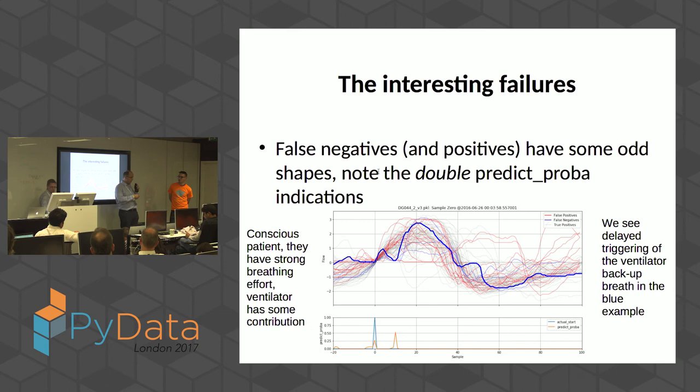Now, that's a very new approach, and some people say this is going to be the future. Some people have criticism because the diaphragm does things which are not mediated by the brain to start the breath, and has diaphragmatic activity which probably in real life doesn't result in ventilation. Our effort to breathe comes from the top. The diaphragm does it, but the diaphragm has extra signals, so there is some criticism of the neural assist ventilators at the diaphragm EMG level, that they have other impulses than just the one which truly represents a breathing effort. But this is one of the futures of mechanical ventilation, yes.